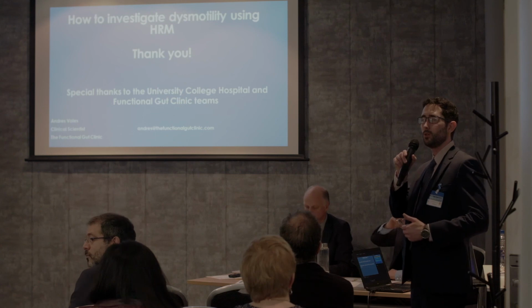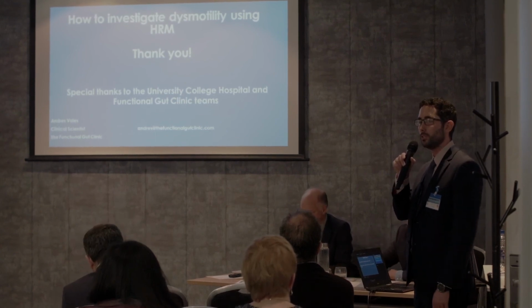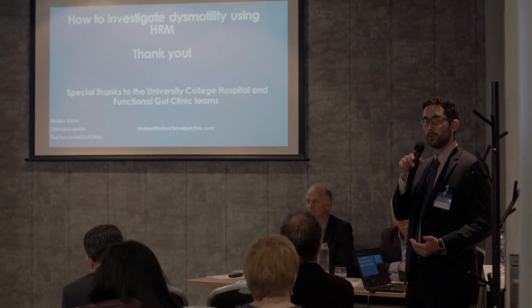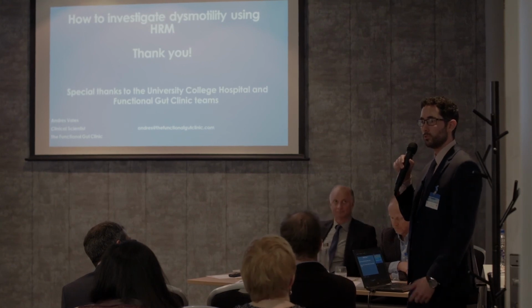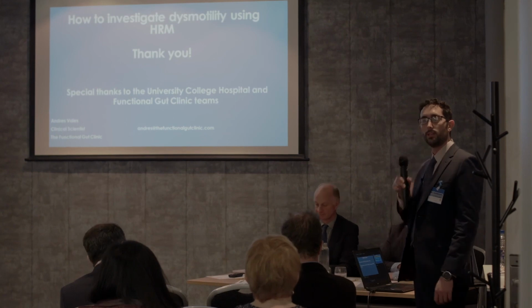So the question there was when the barium starts to comment on contractility, and I think it's essentially similar to that reflux question that Rami was talking about before. They're looking at anatomy and the body of the esophagus. They can't talk about reflux or motility. Yeah, there's a question. Go ahead.